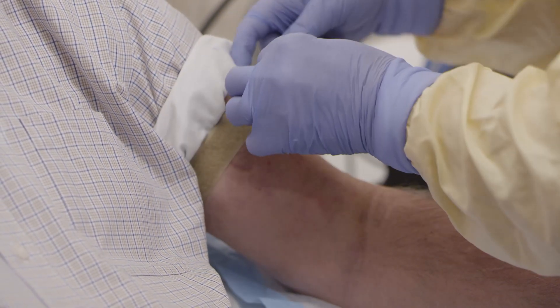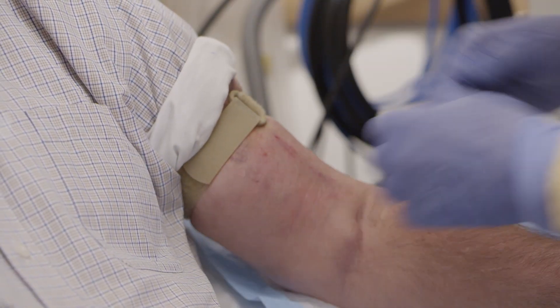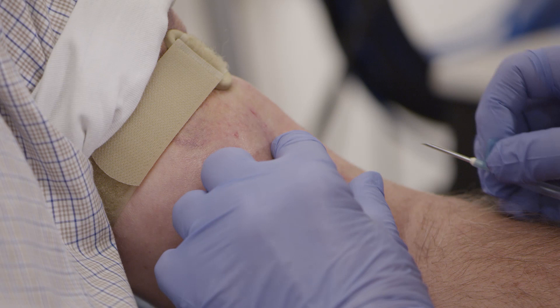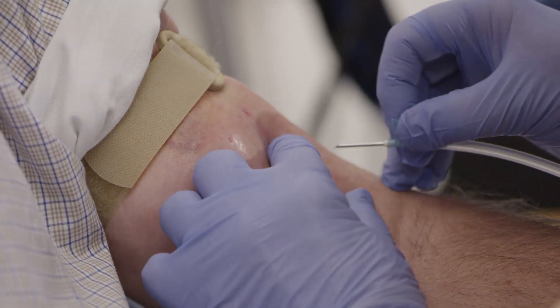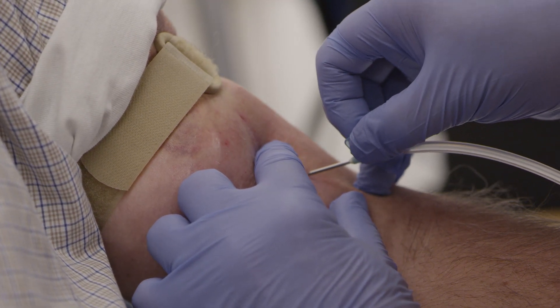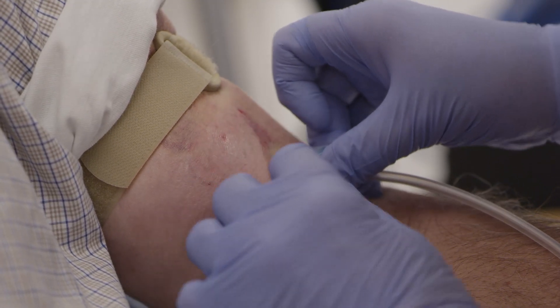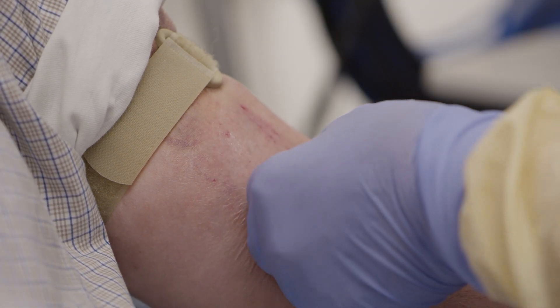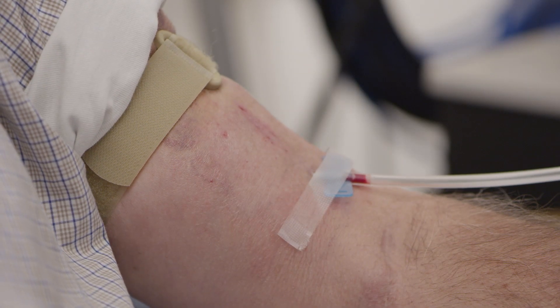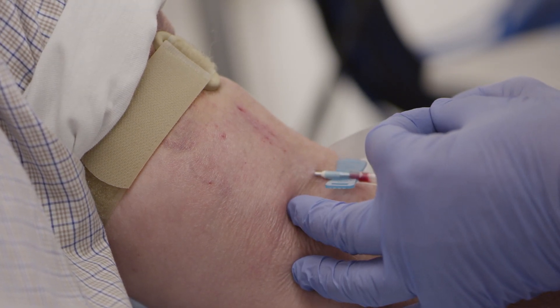Always place a tourniquet above the access sites. Using a tourniquet stabilizes and enlarges the vessel, making it easier to cannulate. Using a sharp AV fistula needle, mate the needle wings and remove the needle tip protector. Align the needle with the bevel facing up over the cannulation site. Pull the skin taut. Cannulate the site at a 20 to 25 degree angle — self-cannulators may require a slightly steeper angle. During buttonhole site creation, the same angle and depth of penetration should be used for all needle insertions. When a flashback is observed, lower the insertion angle and slowly advance the needle. Never insert the needle so far that the hub is touching the insertion site.